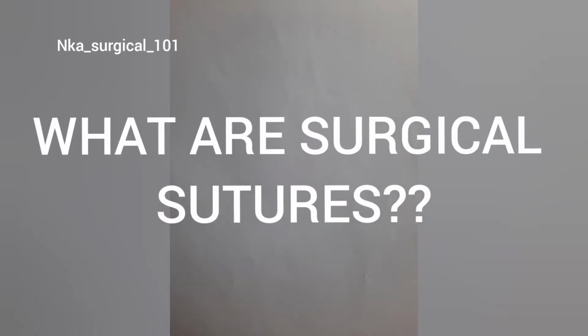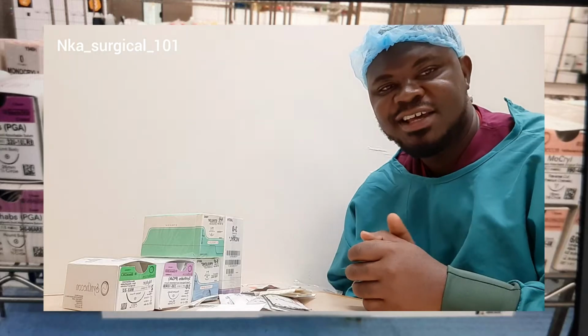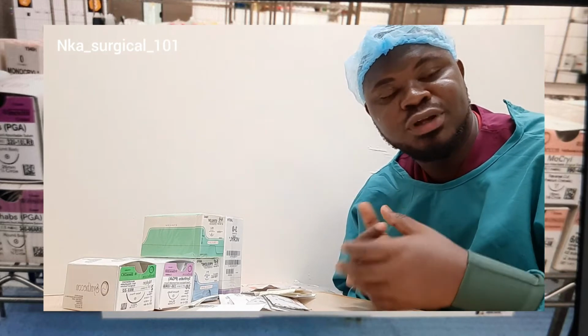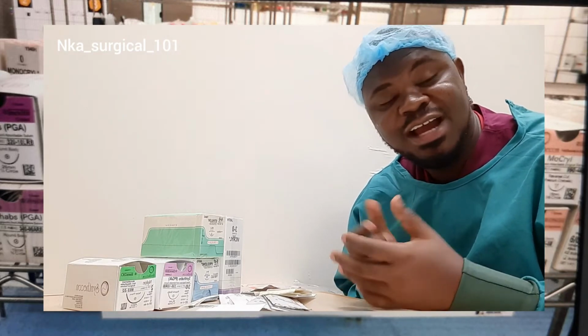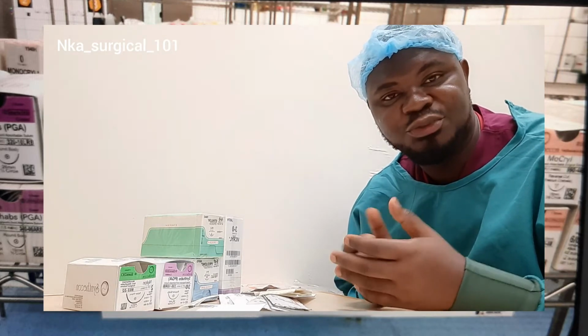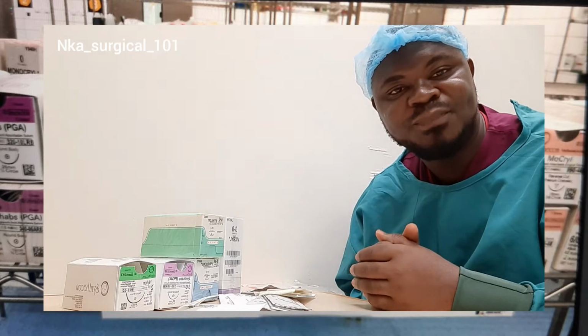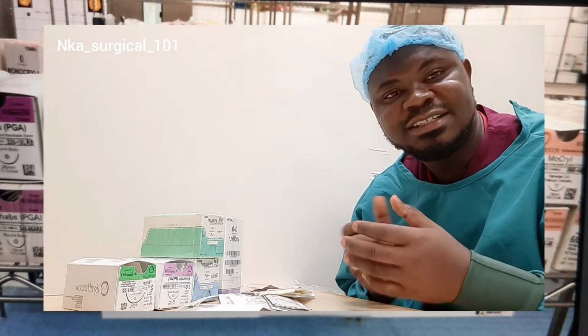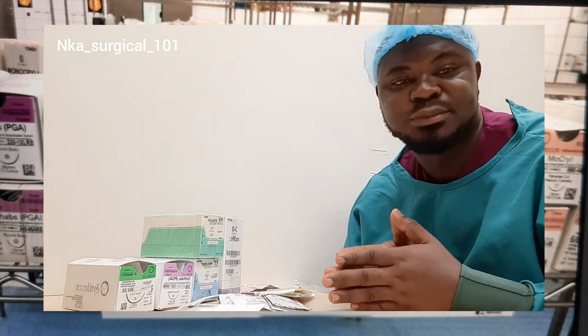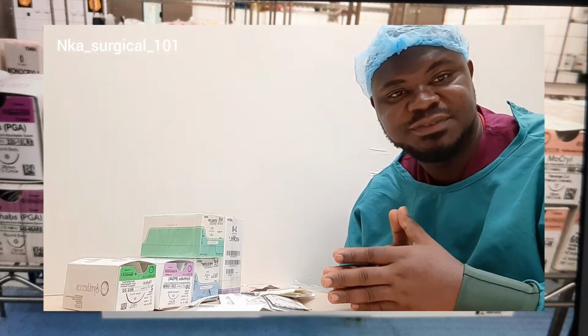On this particular episode, I want to briefly talk about surgical sutures. A surgical suture is a medical device that is used to hold body tissues back together after an injury or after surgery. Most of the times in surgery, tissues are cut or opened, and after the procedure, these tissues are put back together, and this is specifically made possible by the use of surgical sutures.